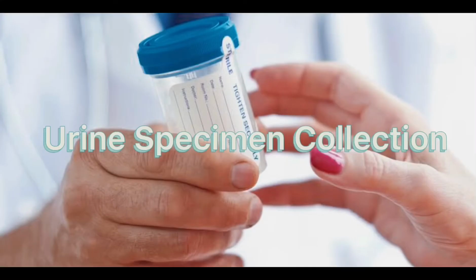Now, the urine specimen has to be taken to the laboratory within 20 minutes. Otherwise, it has to be refrigerated until the scheduled pickup time. Finally, make sure to clean and return the equipment to the right place.